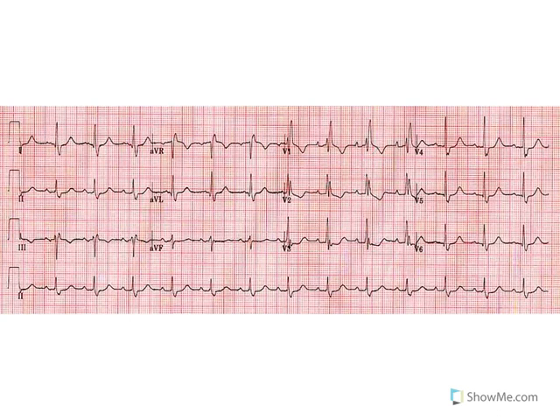Don't just look for RSR prime, although many times you will see it in a right bundle branch block. You will see an RSR prime pattern, but don't just look for the RSR prime pattern. Look at all of the other stuff.